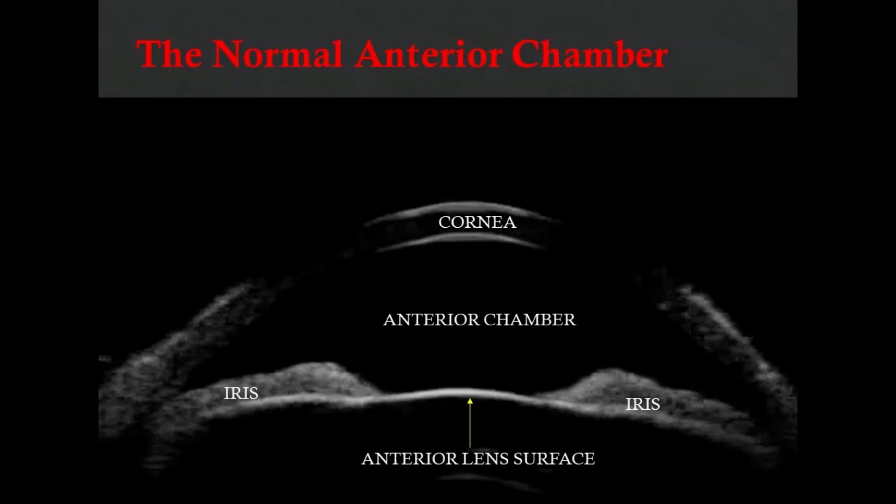In the axial scan, the cornea, anterior chamber, iris and anterior lens surface can be easily identified.